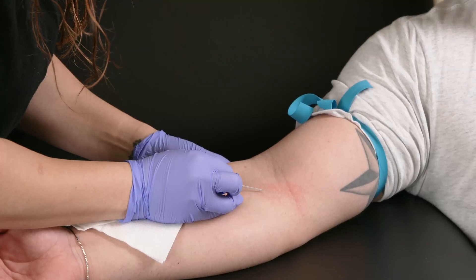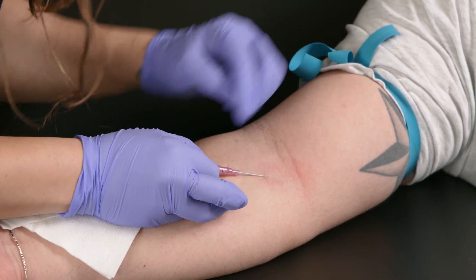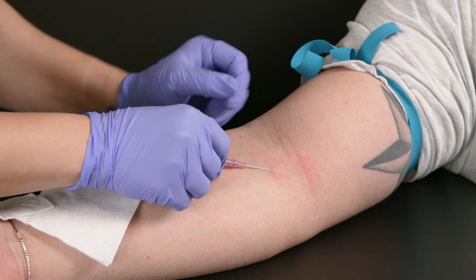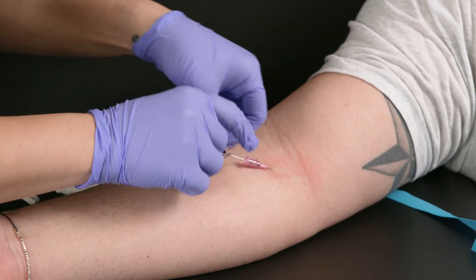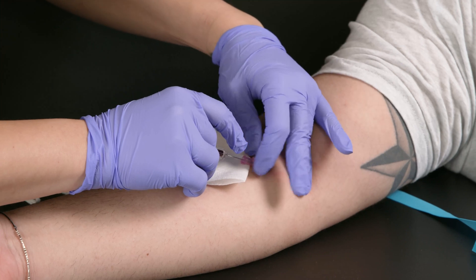We're going to insert — one, two, three. As we insert, we're looking for the blood filling. You can see the blood is filling, which means I'm in the vein. I'm going to insert a little further and then push the cannula in. Once the cannula is in, I like to slide some gauze here, occlude.